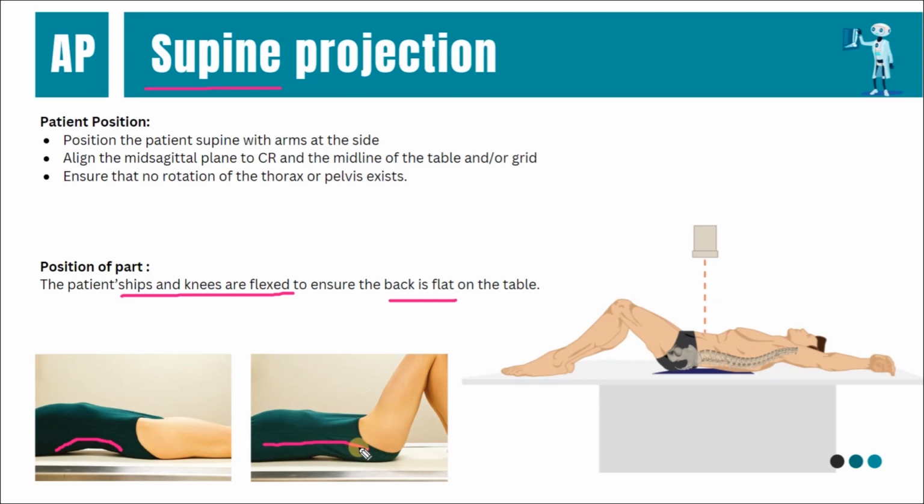Okay, this is a very important tip in the AP supine position. And of course, for the patient's comfort, you can put a pad or a pillow underneath the knees.